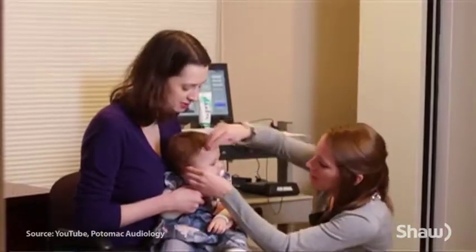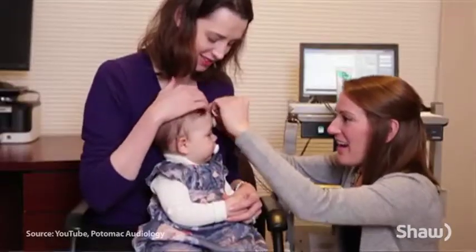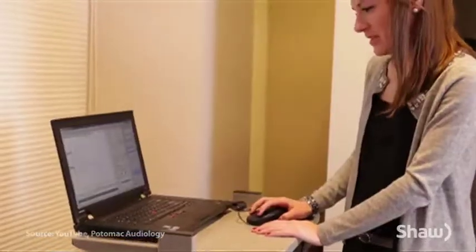We started doing the newborn hearing screening back in about 2003, somewhere right in there. And for those kids who fail this screening, it's really the only way you can get any kind of reliable results until they're about 3 or 4 years of age. So instead of having to wait that long to do their hearing test to where we could safely put hearing aids on, we can do it at 6 months or 3 months, or once we've confirmed that there really is a hearing loss, we can move that along much quicker, which improves their speech and language development and prevents a lot of delays that way.